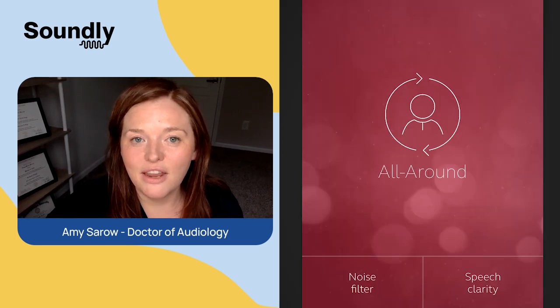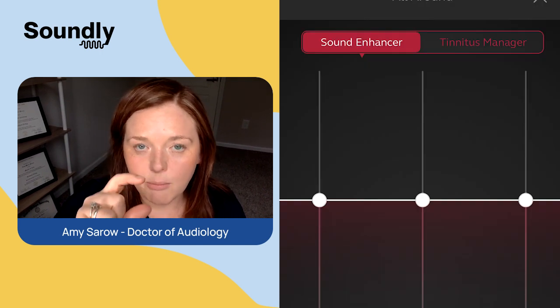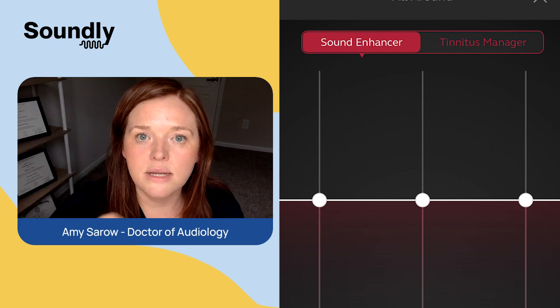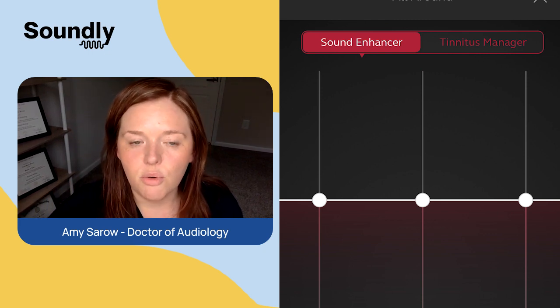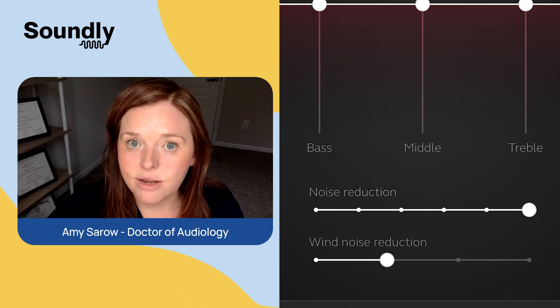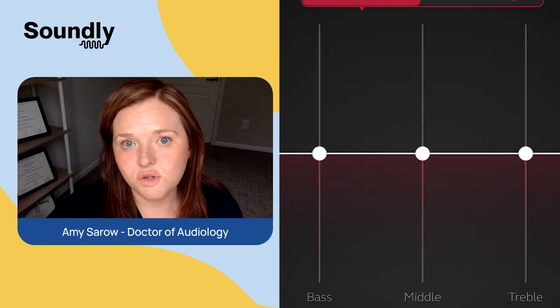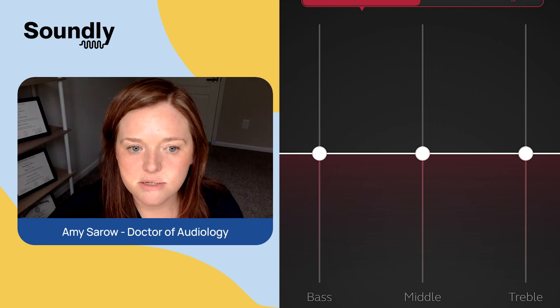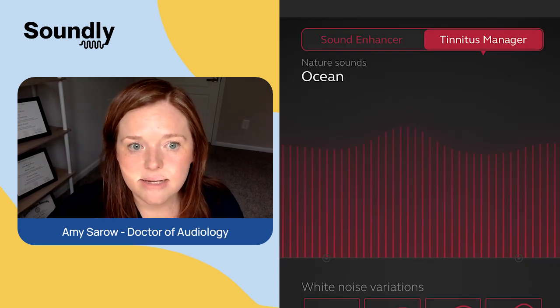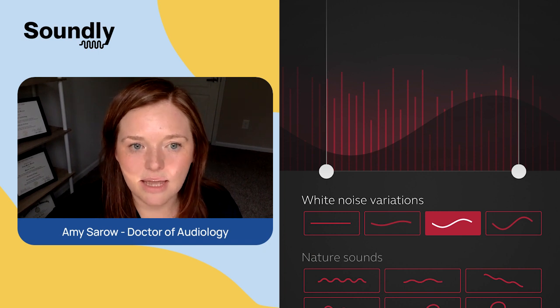Now you are in the app and you're able to use this like a remote control, which is really nicely done. Here on this screen you have your main program, which they call the All Around. Up at the top you'll see if you have other programs like restaurants, or programs your hearing health provider has created. You can also turn on the noise filter or the speech clarity. You can adjust your volume with the slider at the bottom and separate them out individually. You can adjust the sound enhancer — treble, mid, bass. If you have a tinnitus program, you're able to access it under that sound enhancer menu and make adjustments to get the sound how you like it.